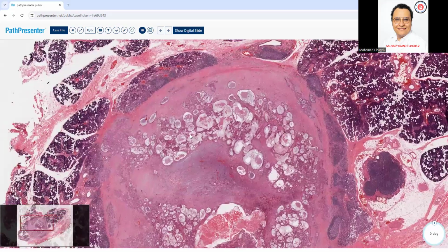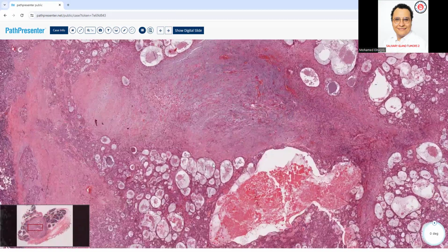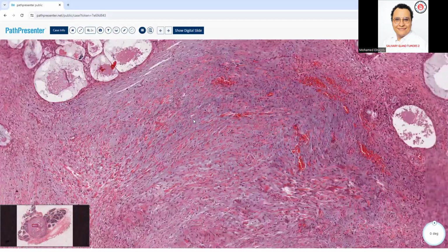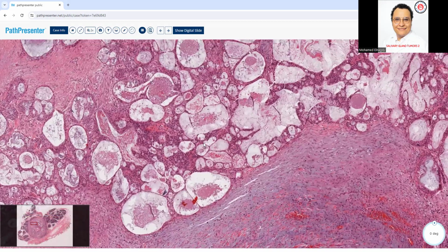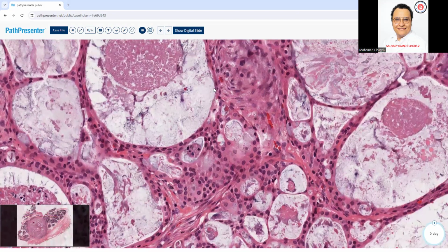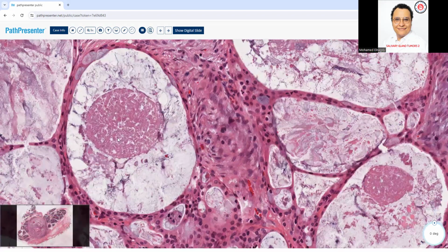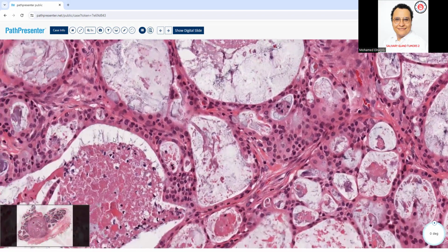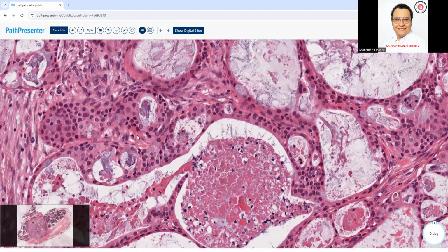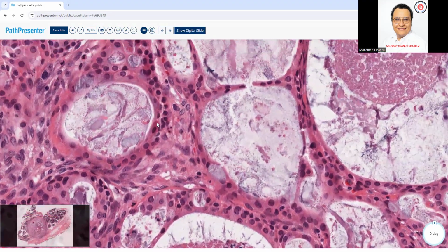And kind of patchy. There are areas that look cellular, other areas look kind of myxoidish, maybe. Yeah, like this here. This one has some kind of myxoidish area. Yeah, I agree. And spindle cells in between. Some spindle cells, but let's look at these areas. Here they're forming big cystic spaces, and the cells, I want to say these are like the ductal cells.